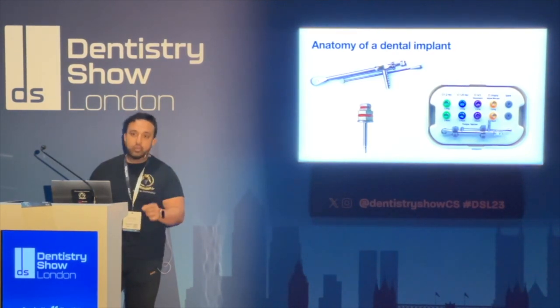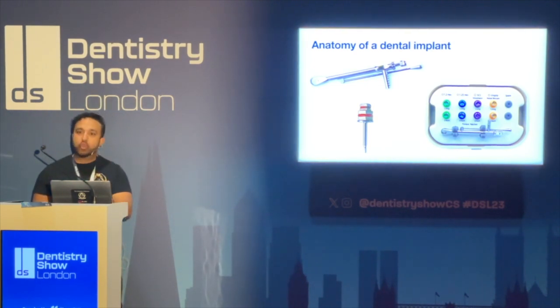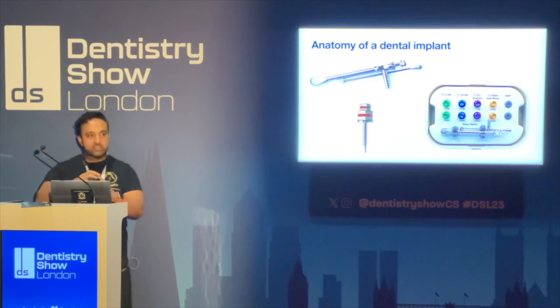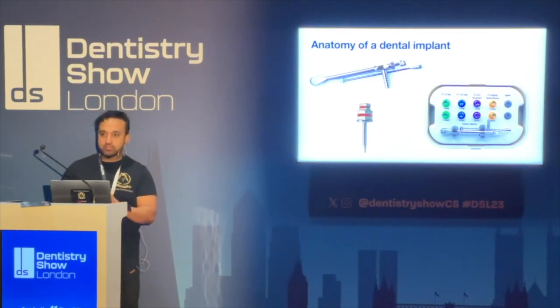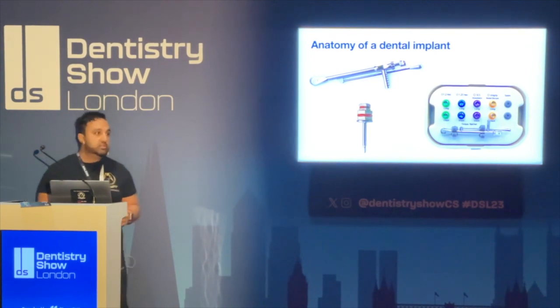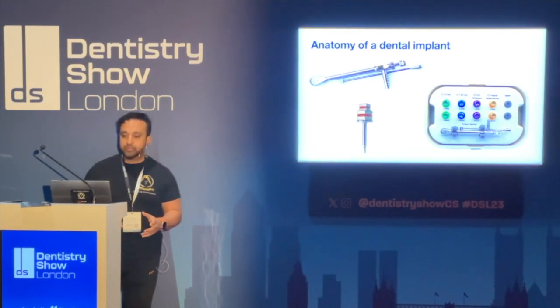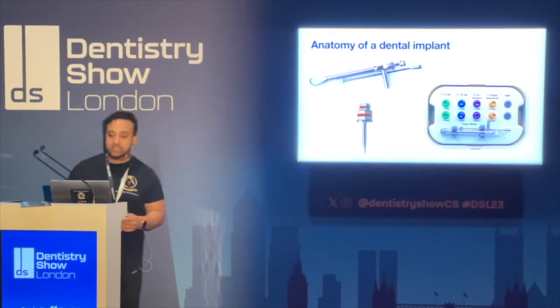And it's really important to understand that different manufacturers of implants will have different torque values that you have to screw the abutment down with. It's really important to record in your notes the actual value that you're going to torque this screw down on, if you can actually tighten it. And you'll be saving yourself a lot of hassle, basically.